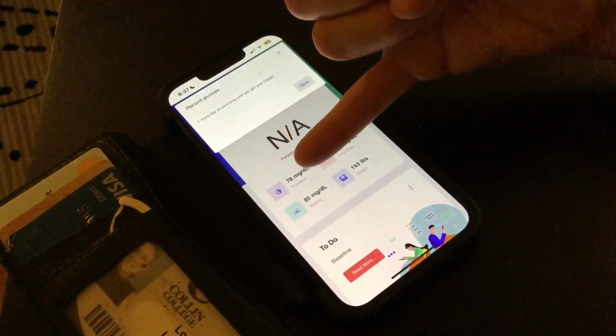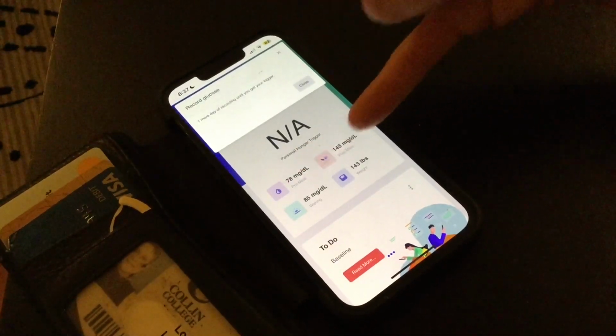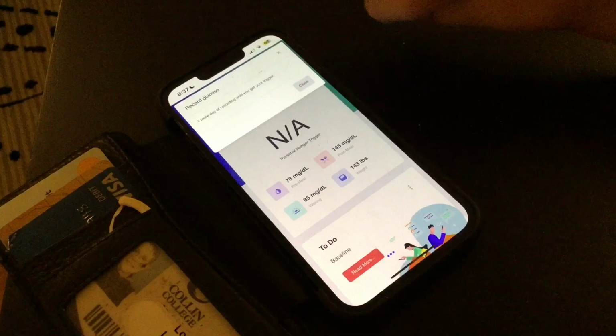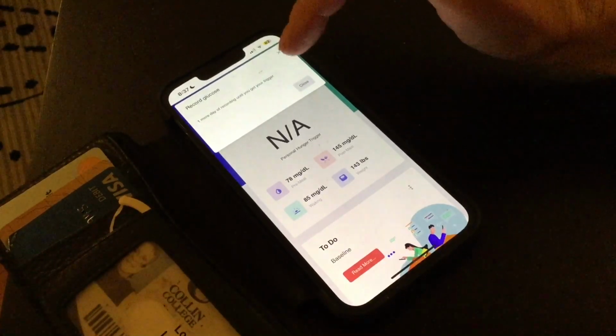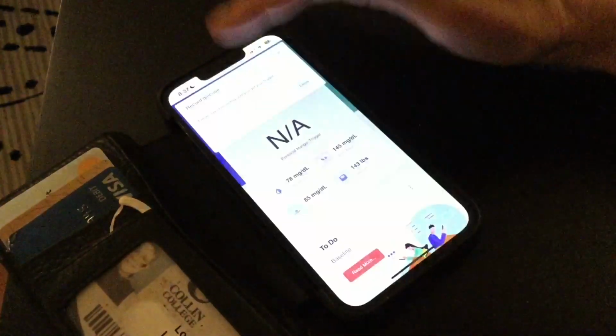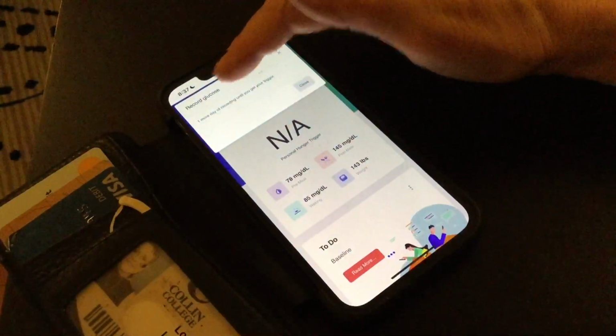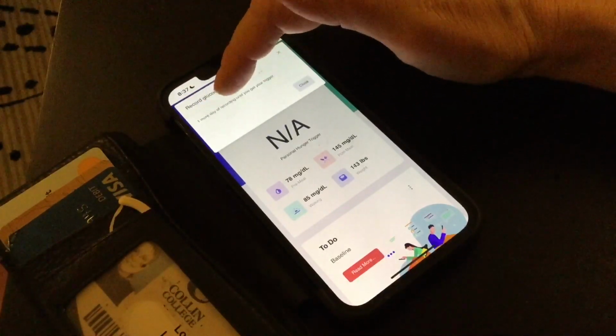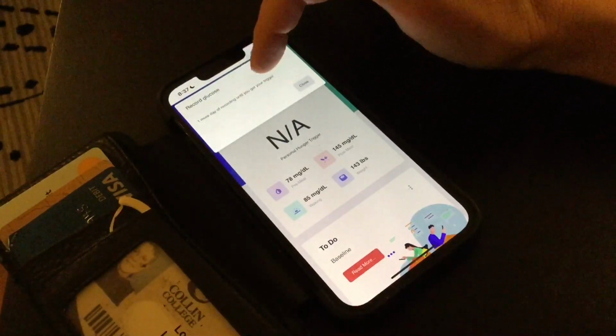My pre-meal number was 78. That's quite a big spread, so I know that wasn't a good meal for me. That's fine. And I get a message up here that tells me record glucose one more day of recording until you get your trigger.